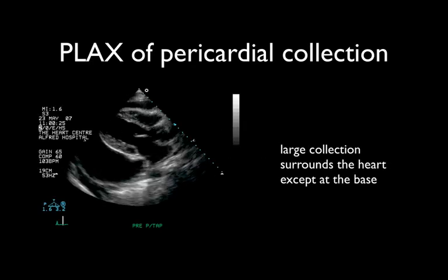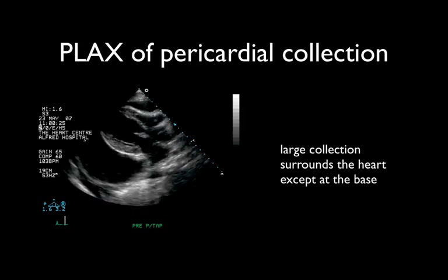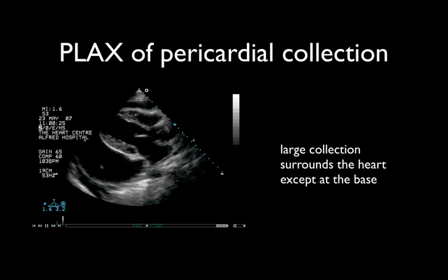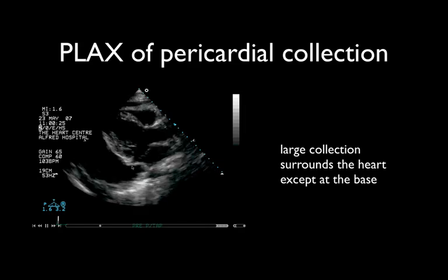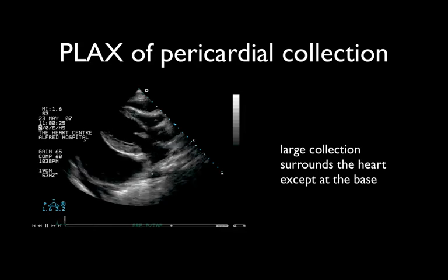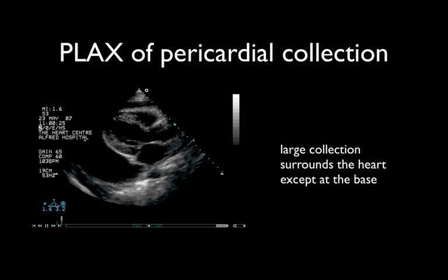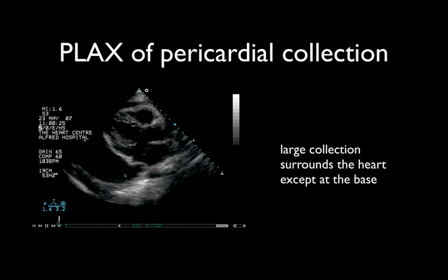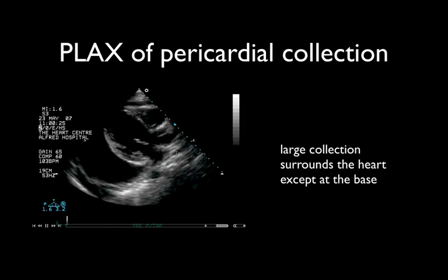Here is a parasternal long axis view of a patient with a large pericardial effusion, seen as a black space surrounding the heart within the pericardium. It's tracking anterior to the descending aorta, as opposed to this pleural effusion which is in a more posterior plane. The fluid can be seen entirely surrounding the heart except where the heart is tethered at its base.